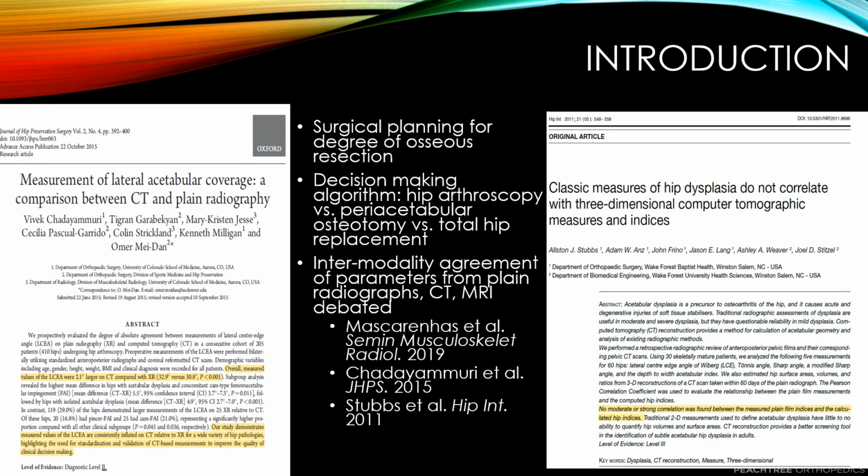In young adults with hip pain, it is critical to understand the osseous morphology in order to assess the current cause of pain, prognosticate, and render treatment. This is frequently determined through quantitative and qualitative measurements on plain radiographs.